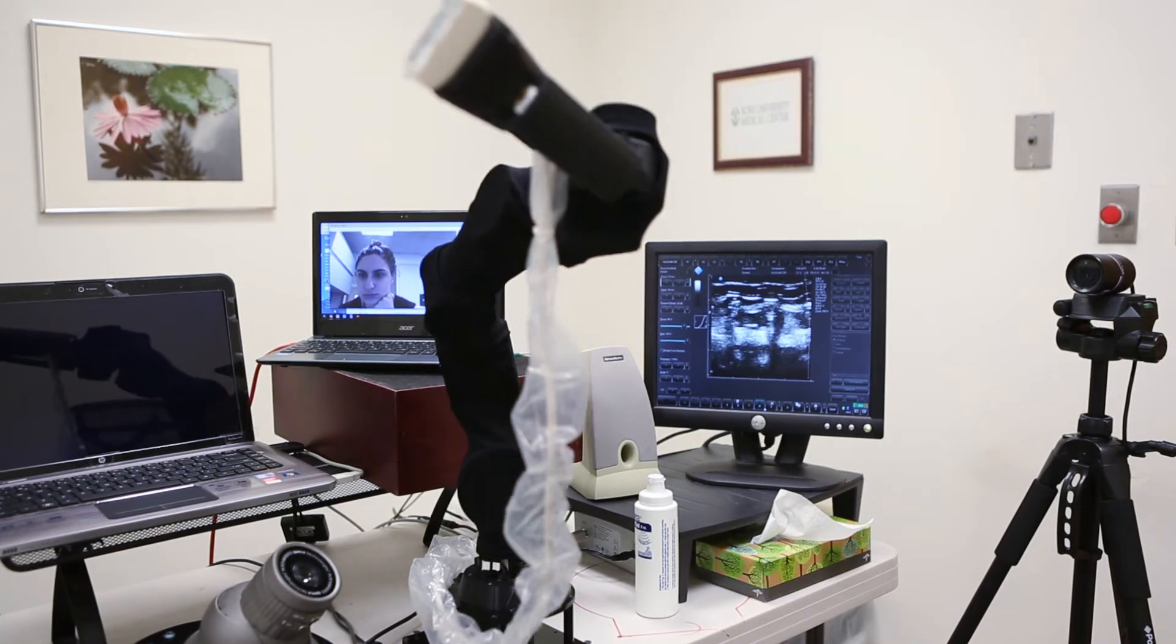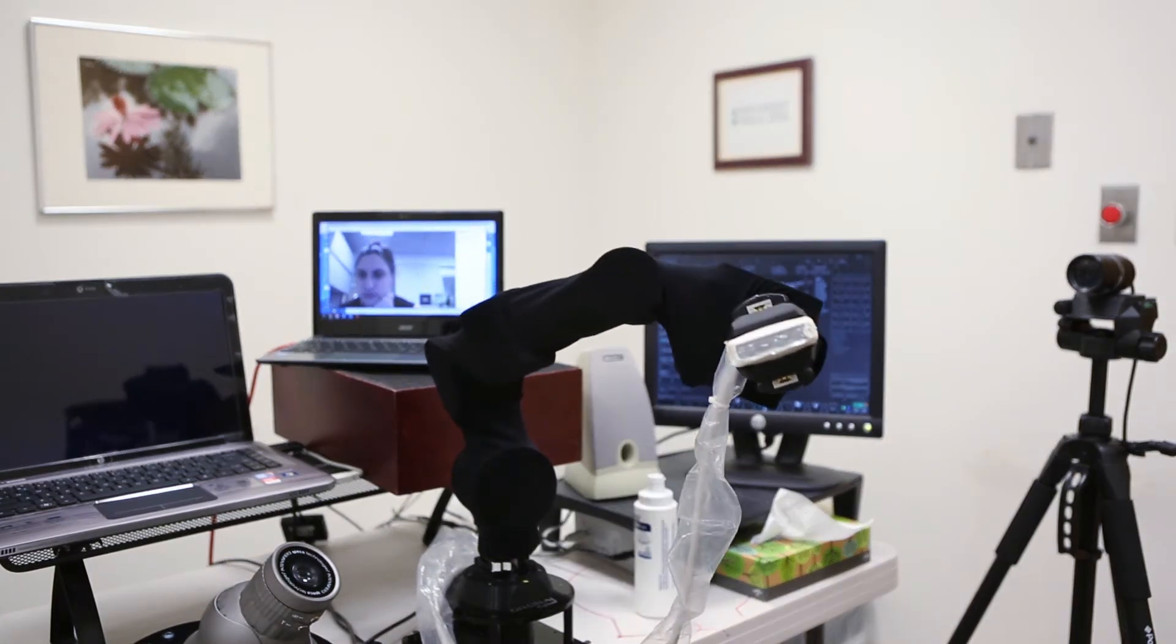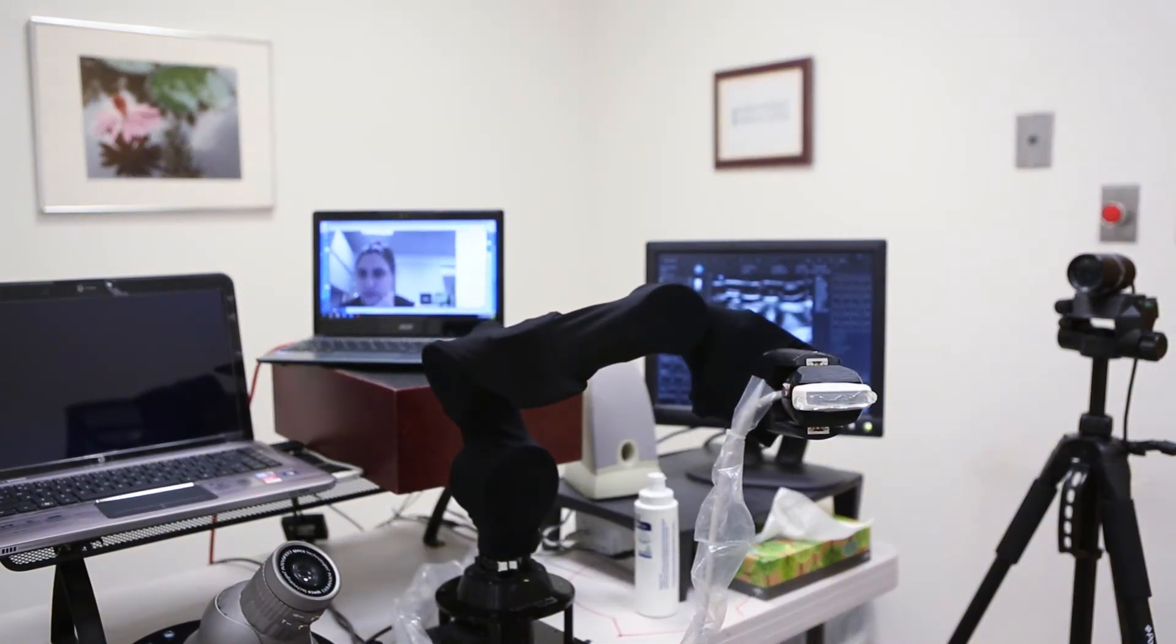But what we've done is combine that with a robotic arm, which allows us to control that probe on the patient's chest or abdomen or whatever part of the body we're imaging.